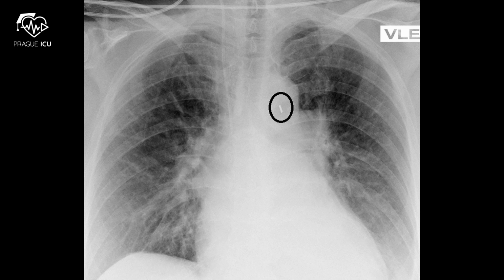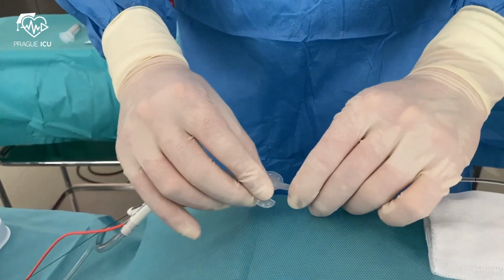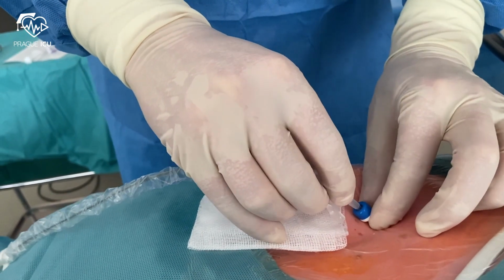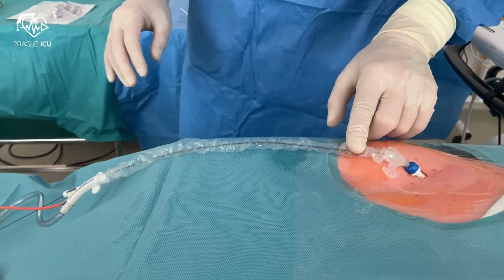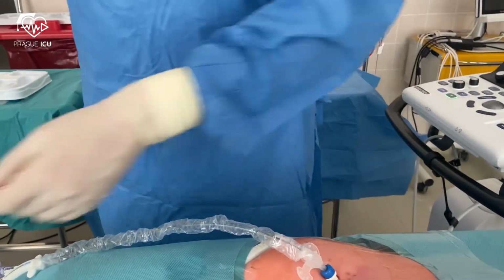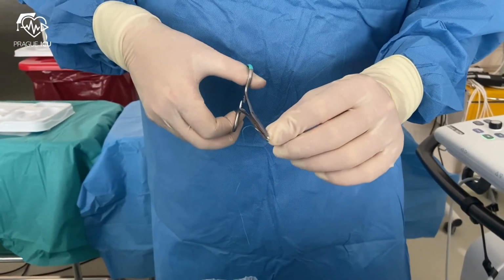Or chest X-ray or fluoroscopy confirms the radio-opaque tip lies approximately 2 centimeters above the carina. Advance shield sheath into hub of sheath. It will allow you repositioning of the balloon catheter under aseptic conditions. Secure the catheter to the patient's leg with sutures.